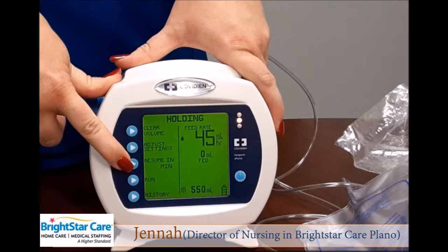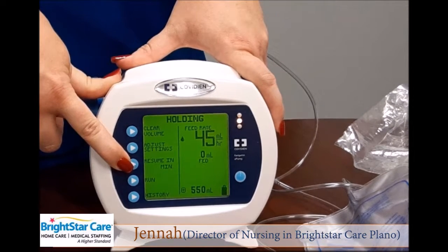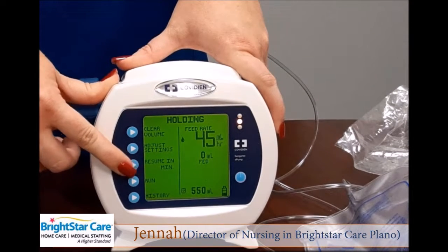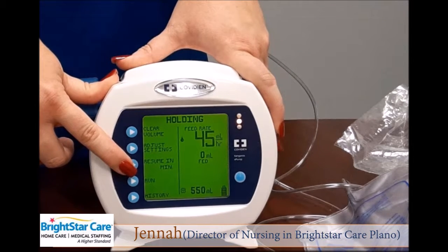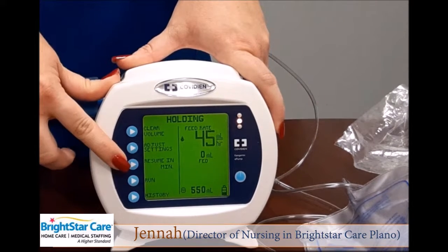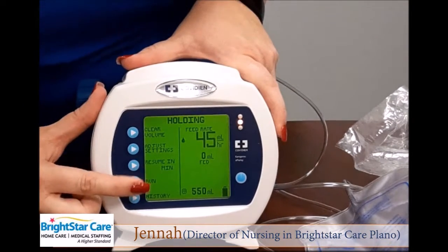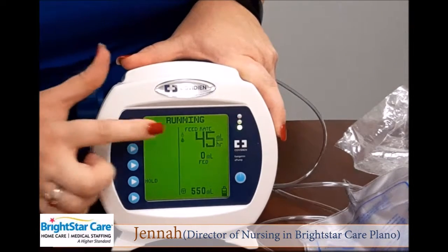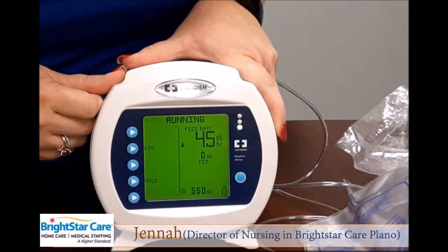So for instances where maybe you had to go and put in a medication, but you can't eat for 30 minutes after taking it, I can actually go in and set that for 30 minutes, in which case the pump will then automatically count down the 30-minute timer and restart itself at the preset rate after the 30 minutes has expired. In my case, I just want to restart my pump, so I'm just going to select my run option. As you notice, again, I have a drip and a green light, which tells me that my pump is functioning.